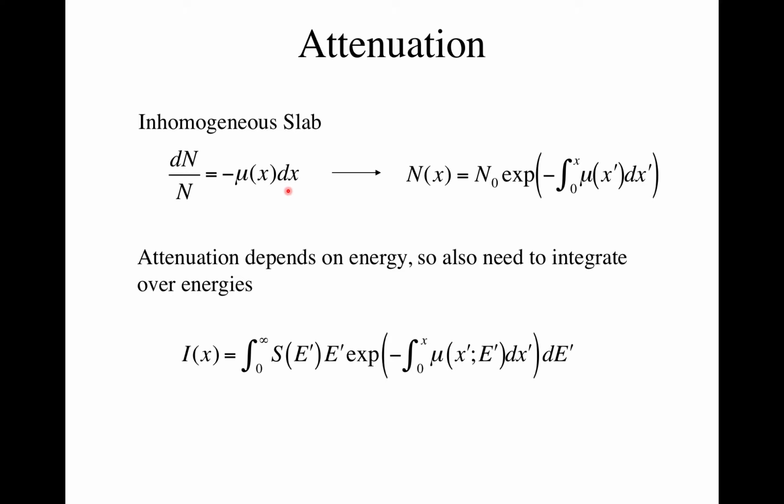But if I have my spot where my X-rays are coming from, and I draw a line from that spot to a detector element on my detector, along that line, how many photons are going to get absorbed? As I pass through the patient on that ray, I'm passing through multiple different tissue types. I'll hit skin, then fat, then perhaps a rib, then some muscle, then lung, air, and then the back of the rib, and then out. So I've gone through some very heterogeneous X-ray attenuation as I move through that tissue.